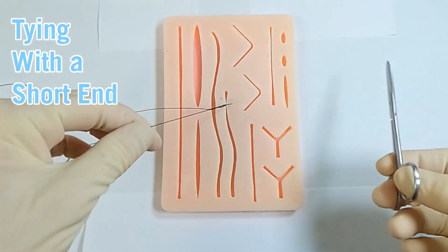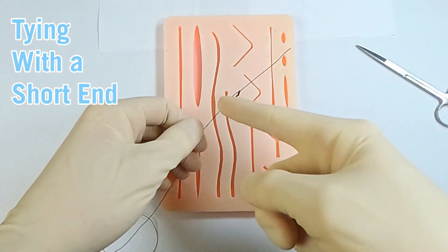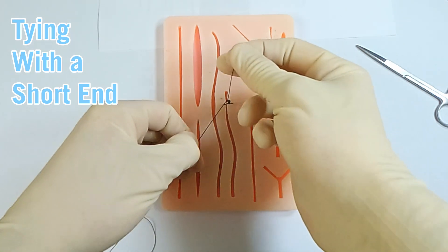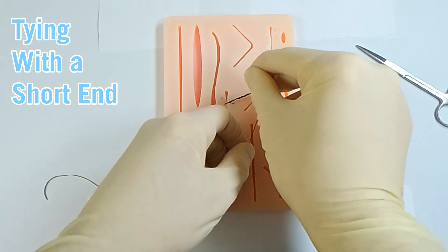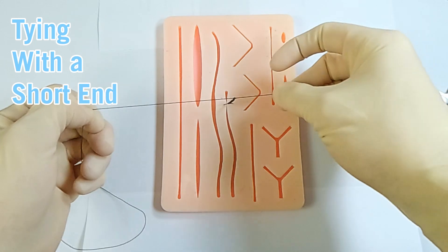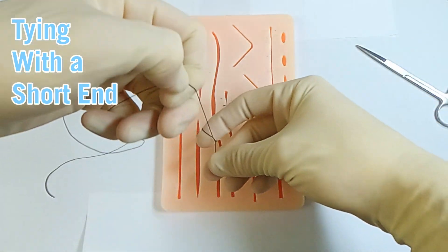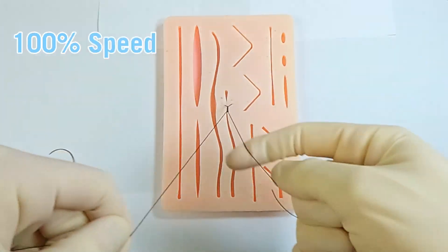Something to practice with is tying with a very short end of suture, because the first time you get handed a suture to tie in the operating room, it might be shorter than you practiced. A key with throw B is to pinch at the very end in order to do this movement. It is doable with shorter suture than you think — pinching at the very end, you can slowly but surely work the suture through to complete the knot.